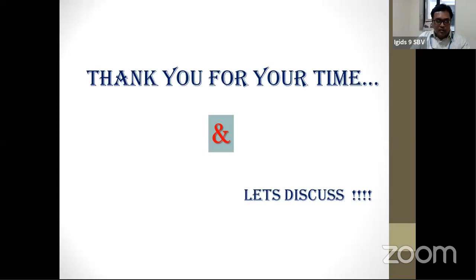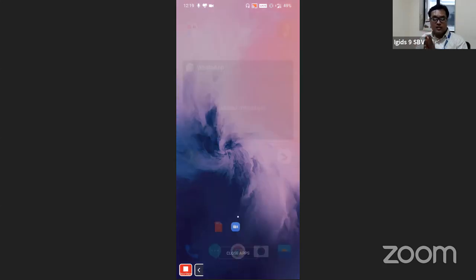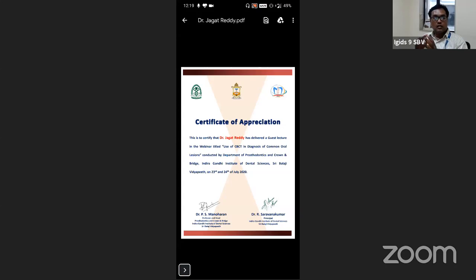I have another question from one Dr. Chitra. Question says, is CBCT compulsory for cysts and tumors, or is an OPG alone sufficient? Okay, that's an interesting question. CBCT is an advanced radiology imaging technique where the amount of information it will flood you with is way beyond that of an OPG. But everything comes with a cost. So it's up to you to decide whether an OPG is sufficient, because the exposure parameters of an OPG are a lot less compared to a CBCT. But a CBCT's exposure parameters are a lot less than a regular CT or a medical CT. So it's up to you to decide.